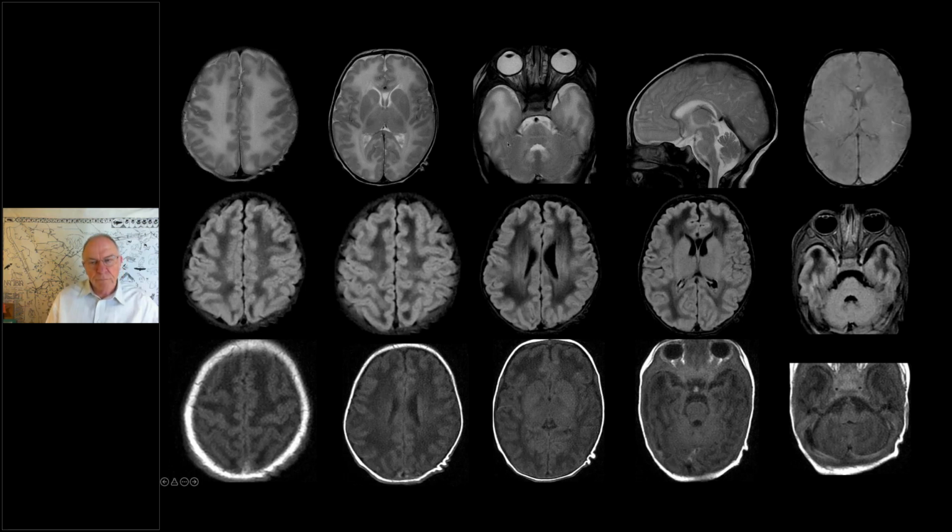I don't see any abnormality in the basal ganglia or the thalamus. The persistent cavum septum is a normal variant at this age. No cortical malformations or myelination disorders. The lenses are visible, but not opacified, but I would not rely on the MRI for diagnosis of cataract.